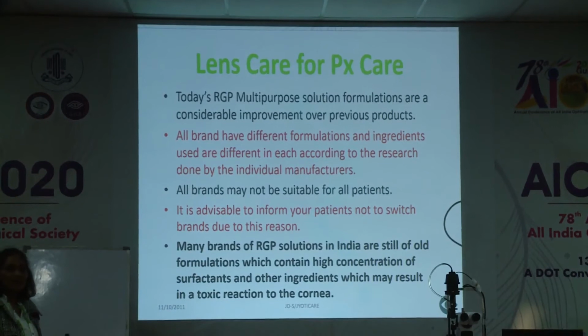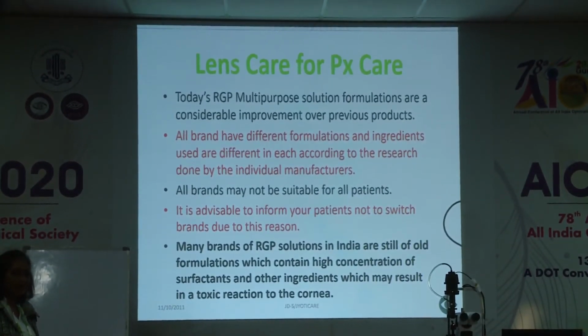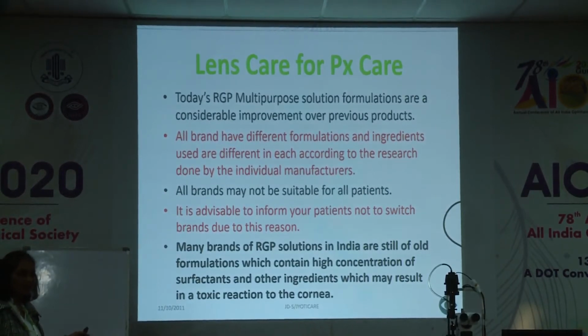For prescribing a solution for your rose-K lenses, you need to have a specially made solution for the rose-K lenses. In India, there are 3 or 4 companies available who will provide you with this. Please ask the distributor how to get these solutions.